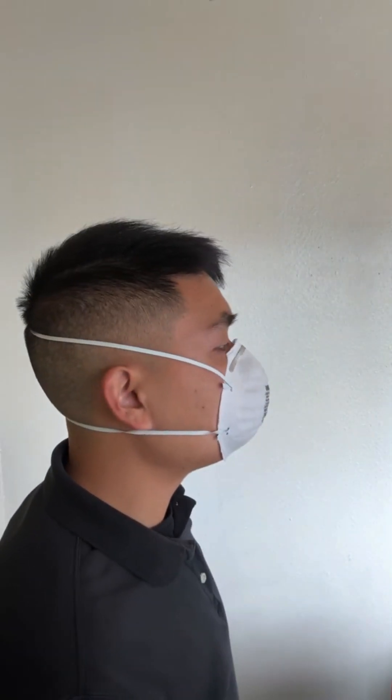To then check for air gaps, gently place your hands on the N95 respirator, covering as much of it as possible, then breathe out. If you feel air leaking out from the edges of the N95 respirator, or if you're wearing glasses and they fog up, it's not snug. Adjust the N95 respirator and try again.